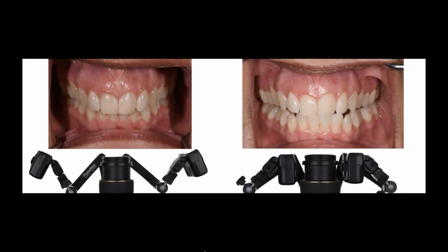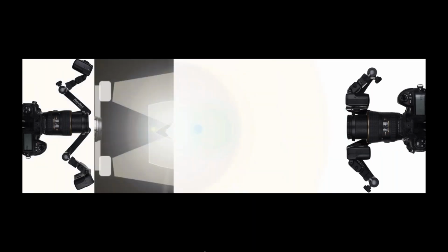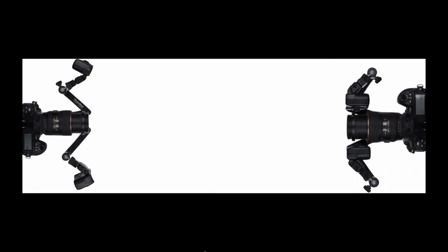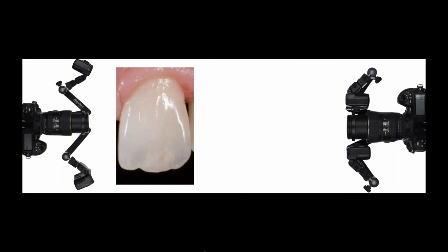Look at the difference in what you see to the left of the screen, to the right of the screen. We need the one that's on the left of the screen. So again, anytime you're talking about color, surface topography, value, I want those flashes towards the outside. Basically, I want this effect to happen, not this effect to happen, where the light is coming too much from one source.